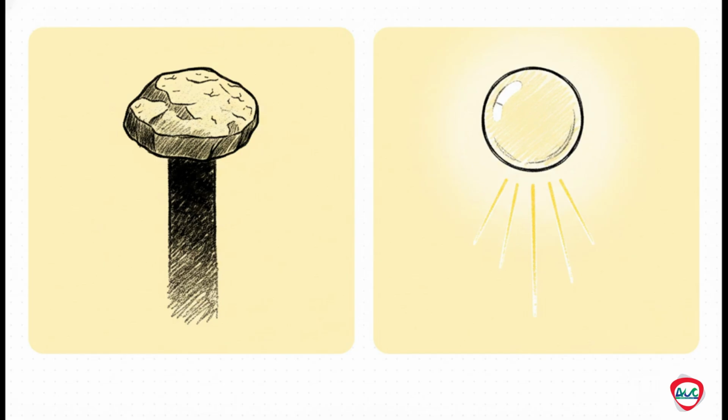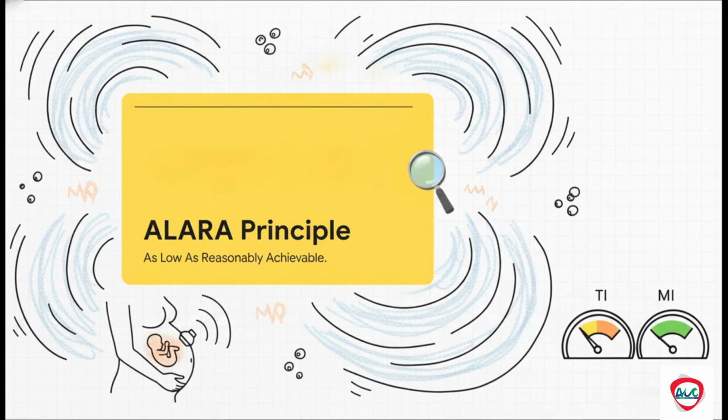Even reverberation and mirror artifacts aren't glitches. They're just showing you exactly how sound is bouncing back and forth across strong reflectors in that specific patient. You're basically acting as an acoustic detective. But while we're having fun manipulating all this physics, patient safety remains absolutely paramount.